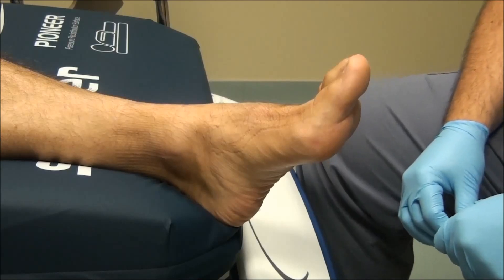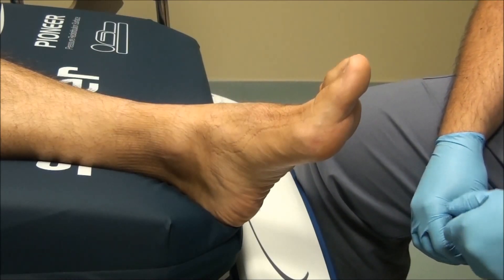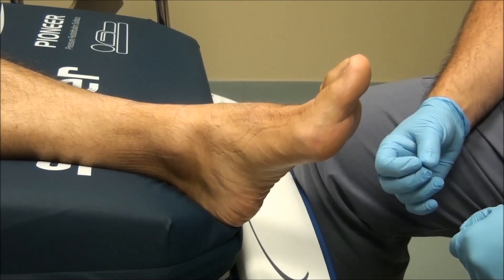This is Dr. Linceras from 360woundcare.com and today we're going to be doing yet another in the series of neurologic examinations of the foot. This is yet another simple, easy to perform point-of-care test.